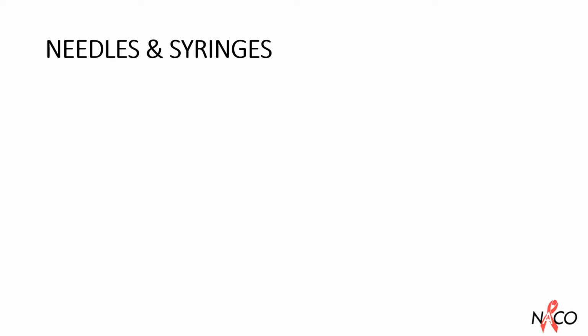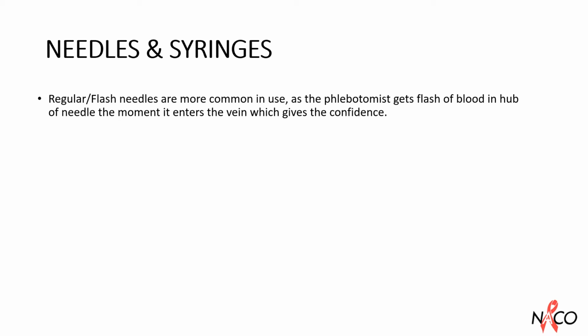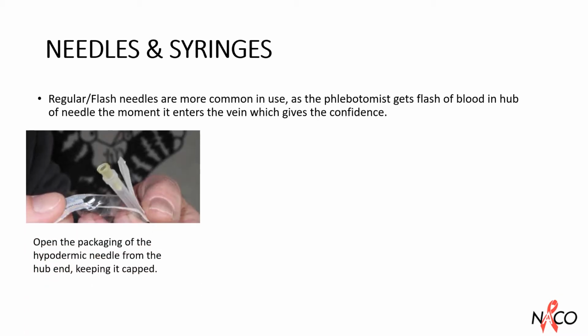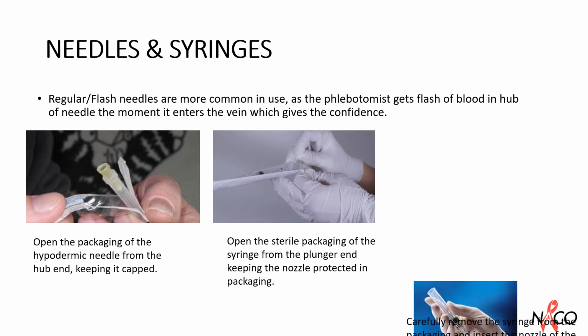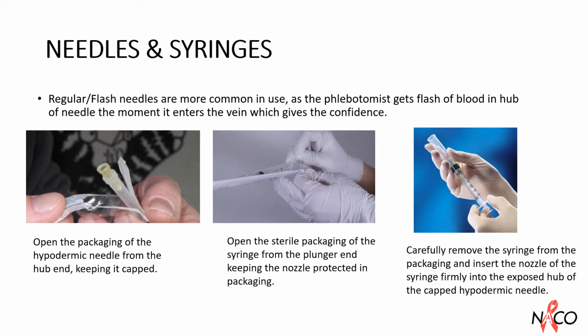Needles and syringes. Regular or flash needles are more common in use as the phlebotomist gets flash of blood in the hub of the needle the moment it enters the vein, which gives him the confidence. To use a needle and syringe system, open the packaging of the hypodermic needle from the hub end, keeping it capped. Open the sterile packaging of the syringe from the plunger end, keeping the nozzle protected in packaging. Carefully remove the syringe from the packaging and insert the nozzle of the syringe firmly into the exposed hub of the capped hypodermic needle.